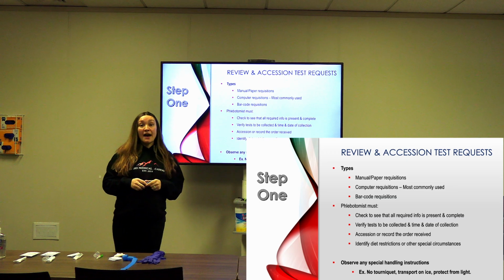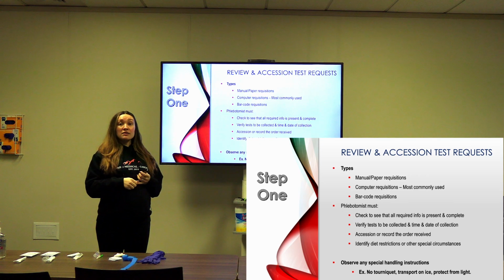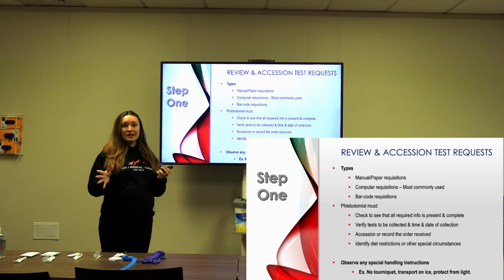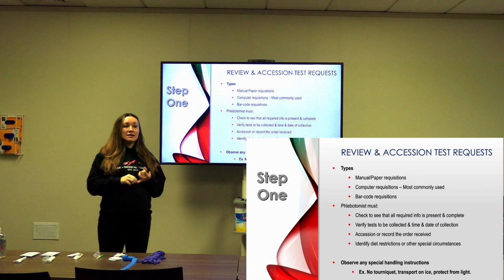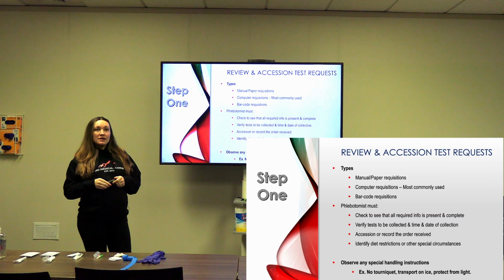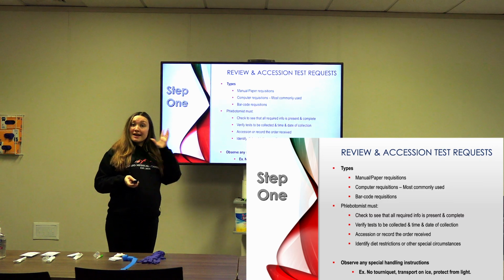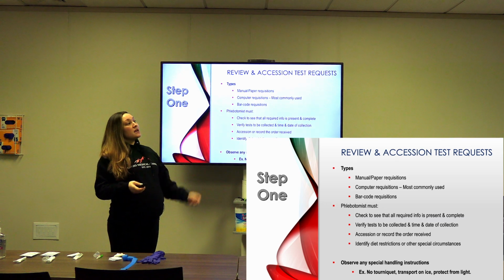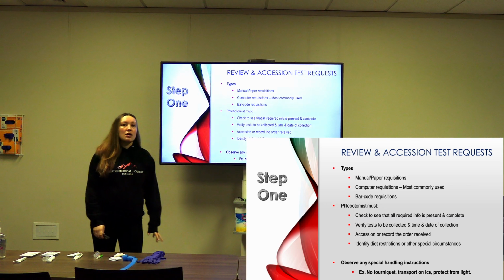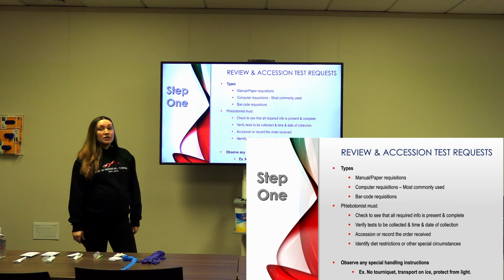If a patient needs to be fasting, which means nothing to eat or drink, including coffee, no cigarettes, stuff like that. If it's a fasting test, I always just ask the patient, when's the last time you had anything to eat or drink? Okay. Sometimes patients know that they're supposed to be fasting. Sometimes patients don't. If they had orange juice or a coffee or a cigarette on the way in, or if they're an inpatient, if they had a coffee, then generally you'll let the nurse know.